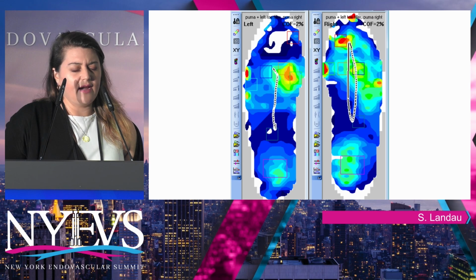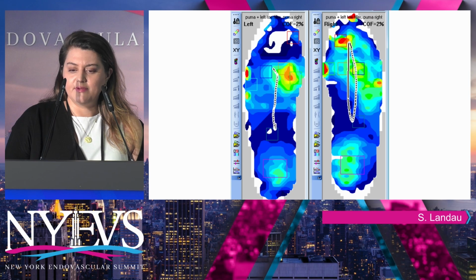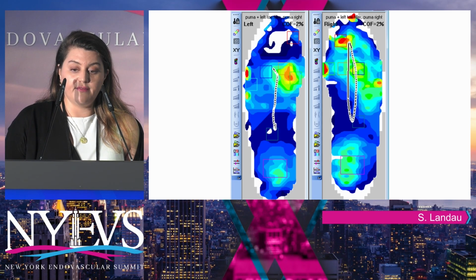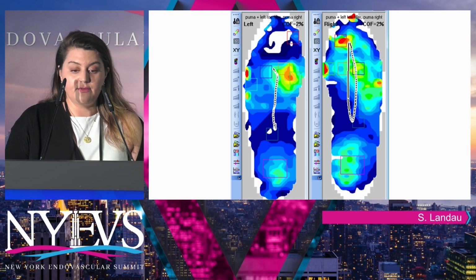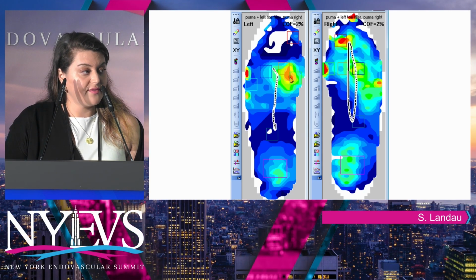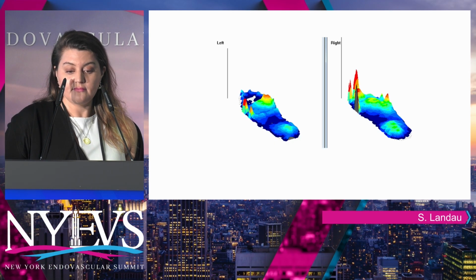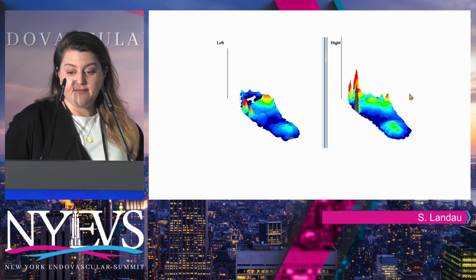And what they gave me for the right side, just so you guys know, was just like a triple layer dual density Plastazote. So you can see this, it was better than the shoe, but it's much worse than a custom foot orthoses that was designed to neutralize all of his deforming forces. Even though this is Plastazote and it's supposed to conform to his peak pressure areas, he's still having peak pressure there. It's because, in part, the proximal deformities were not neutralized. So that stress is still there, and you can see that here. So with a toe filler alone, it's not adequate enough. He definitely needed more.